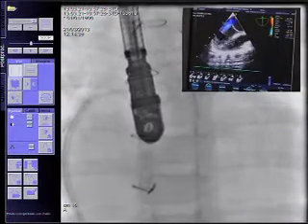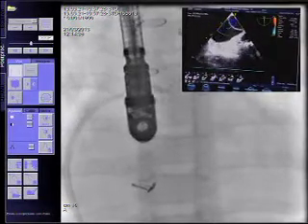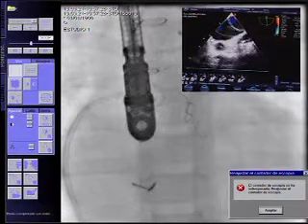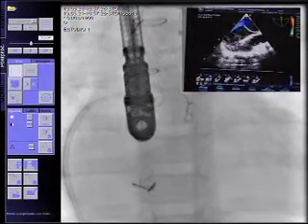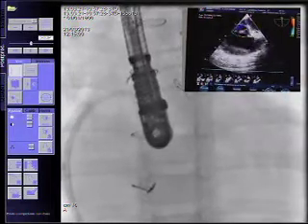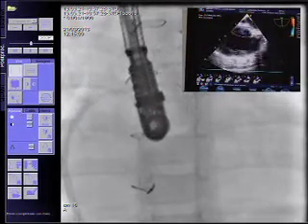Another question, out of plan: I was talking with Federico, maybe in the next catheterization to investigate for veno-venous collaterals. This patient has had high pressures in the pulmonary vascular bed, and maybe we can optimize hemodynamics and saturation also before Fontan, just closing these veno-venous collaterals. I guess we will find them.